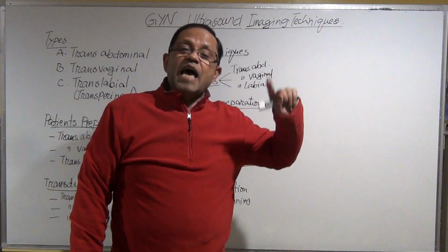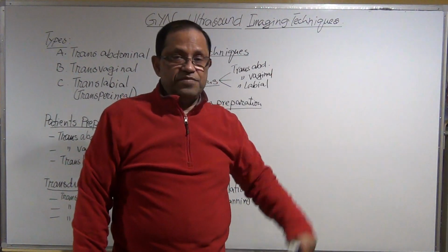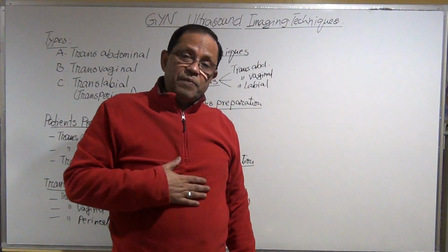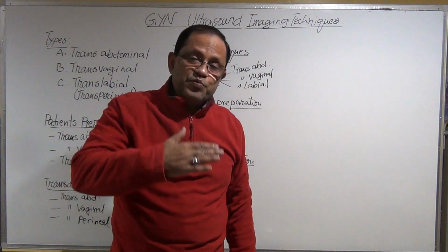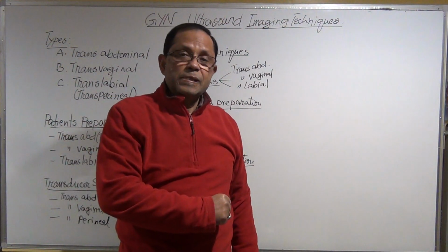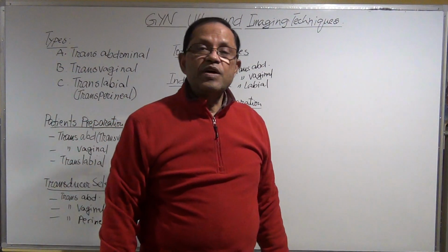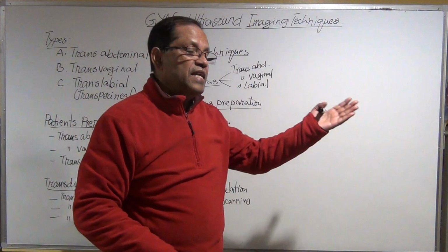So it is happening on and off. Even though the bladder is full, you are scanning, sometimes you don't get the ovaries. Maybe one you got, another you did not.